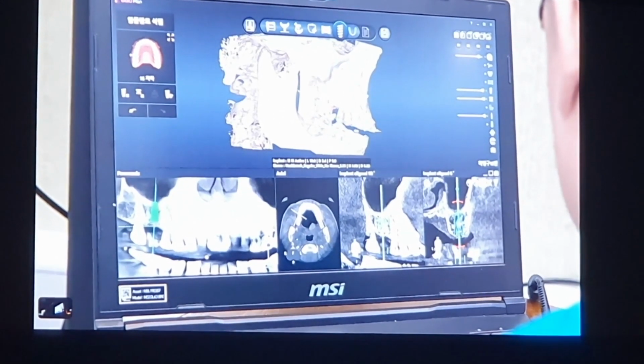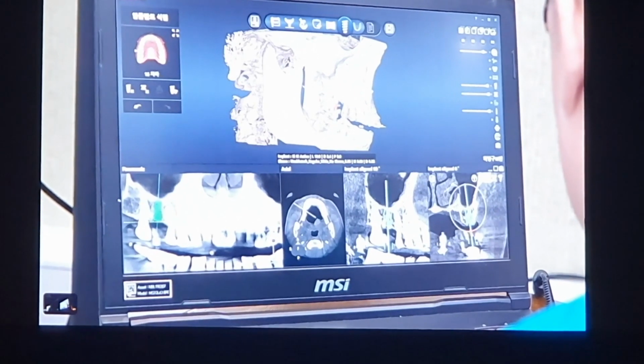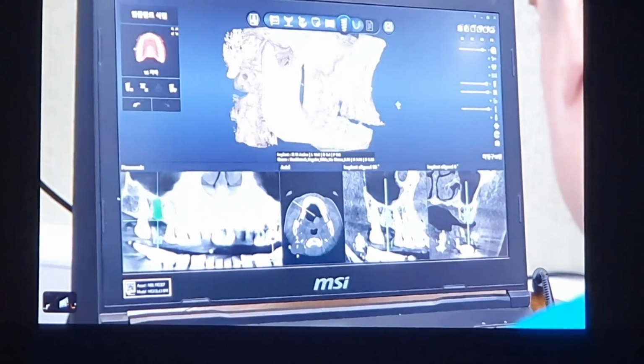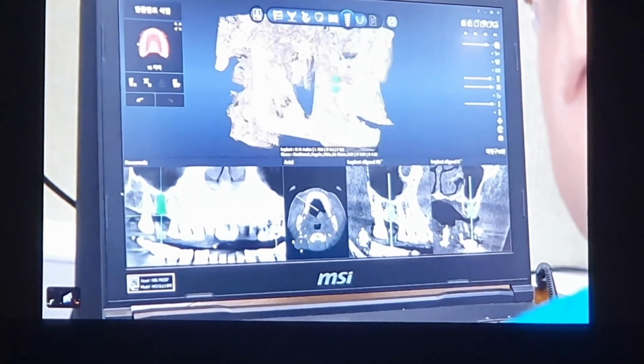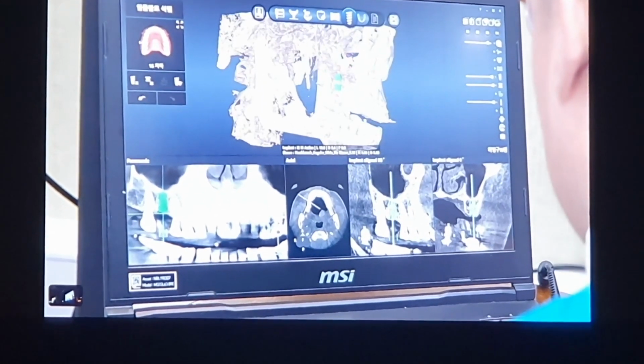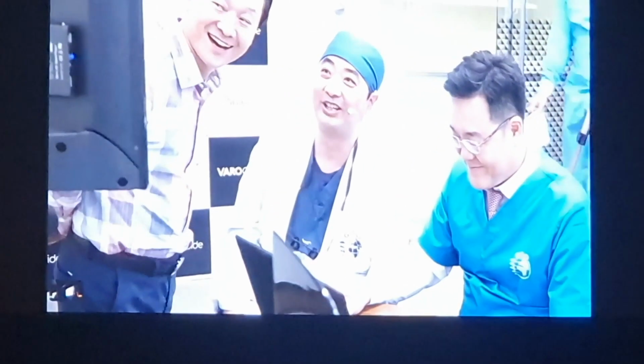So can you display the lower teeth below here? So looking at the lower arrangement, checking the relationship between the lowers through the cross-sectional view. Yes, but I feel extremely pressured right now. The patient is watching every move we make during planning.